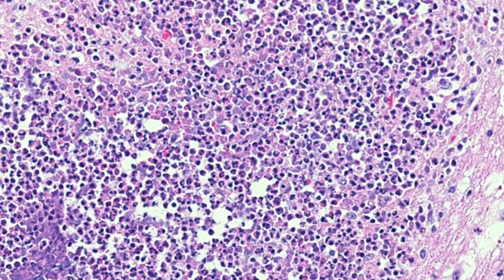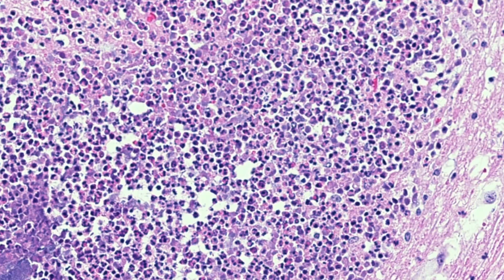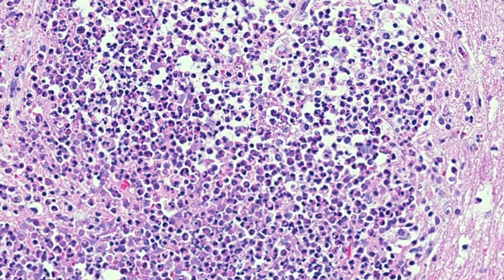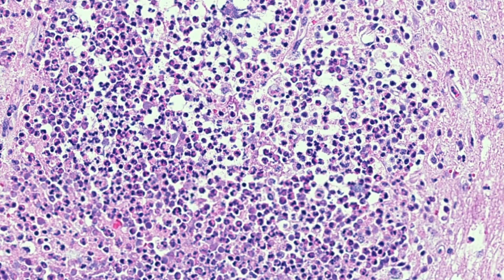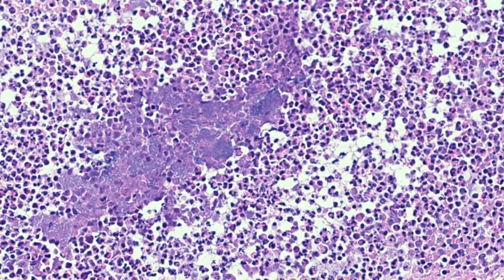Bear in mind that not all of these neutrophils really look like neutrophils. Some of them are starting to break up. Their nuclei are not quite as well segmented, and they just look quite messy. They're not long-lived cells, and they're all spilling their guts everywhere in an attempt to contain whatever it is that's caused the inflammation. In this case, these bacteria within the brain.